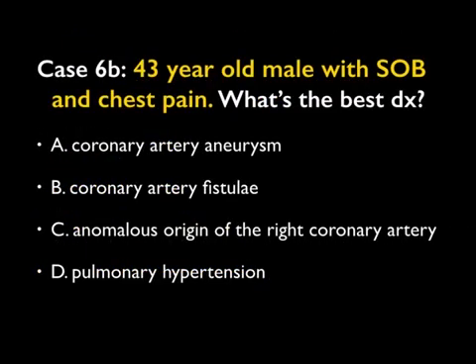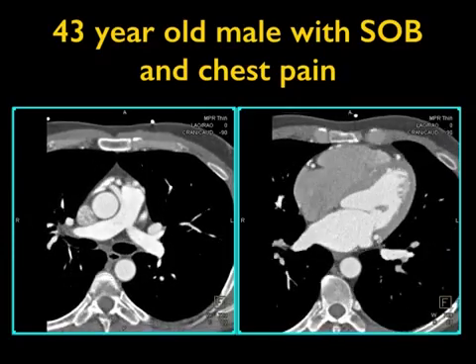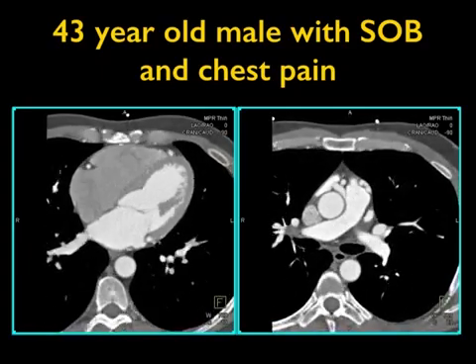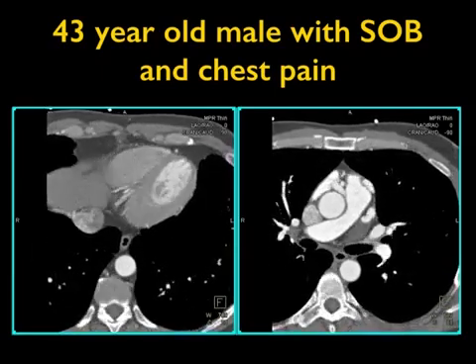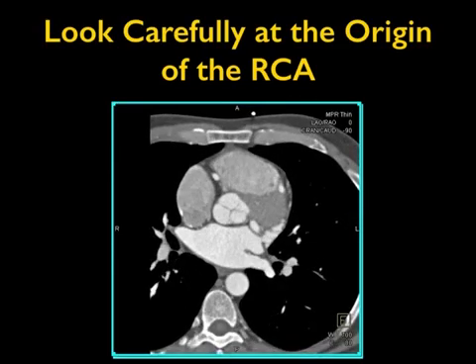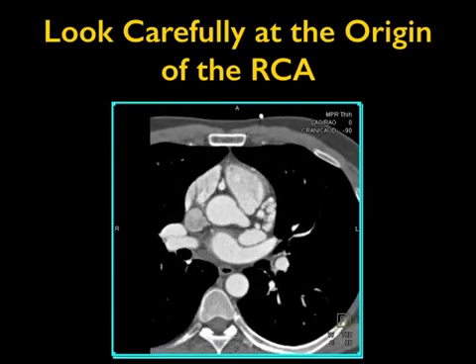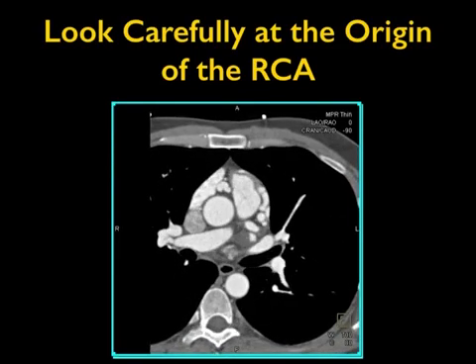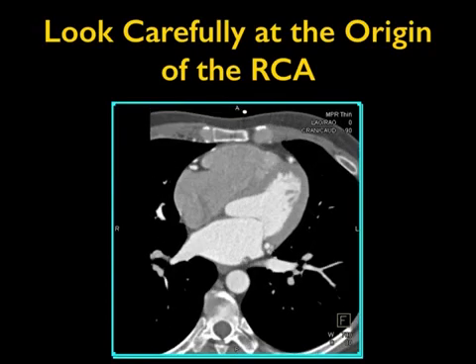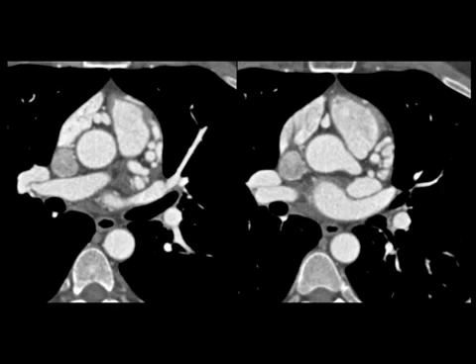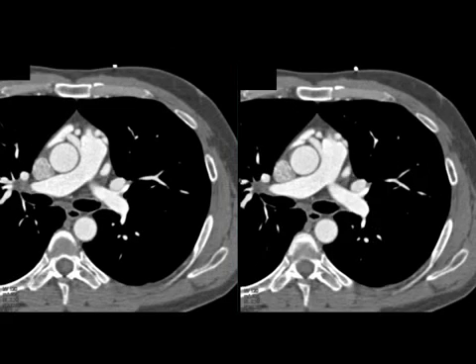Another case: a patient with chest pain. What's the best diagnosis? Looking at the images, scrolling through carefully — note a vessel anteriorly coming off the pulmonary artery. Also notice the tortuosity and size of the patient's LAD. There you see the right coronary artery coming in, but it's not going into the right cusp — it's going into the pulmonary artery. There are a number of collaterals present, particularly near the course of the LAD, visible on axial images.